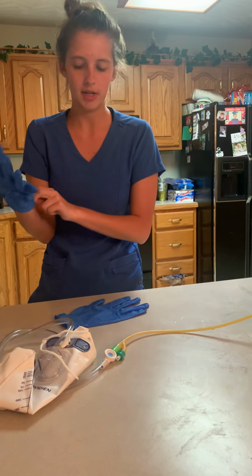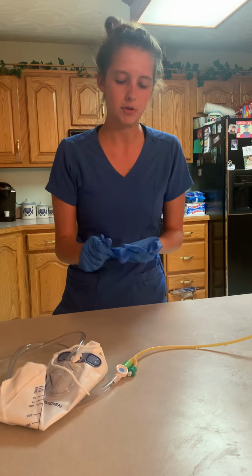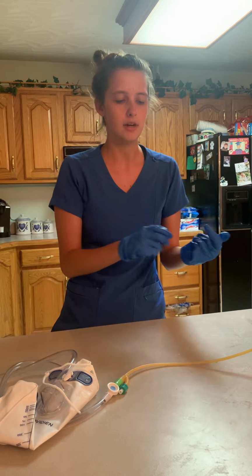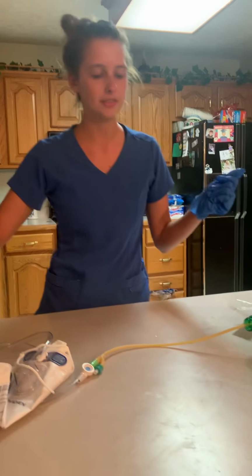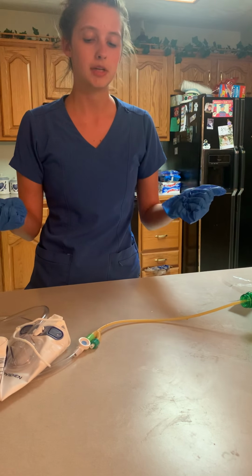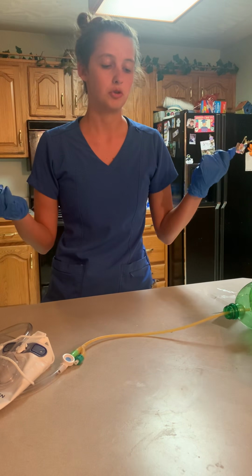And I am going to perform pericare just as I did before, but this time I'm going to clean all the way down the catheter, removing any irritants, such as the betadine or the lubricant, and then we would be able to return the foreskin back to its original position.